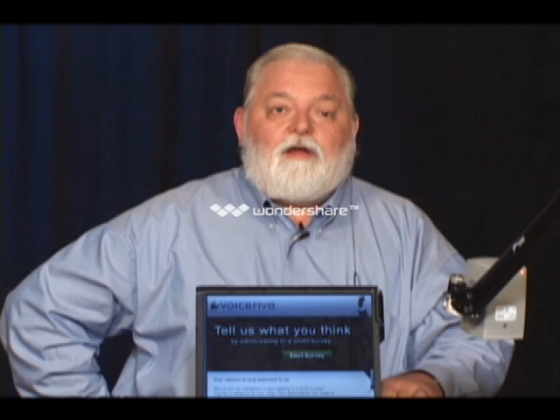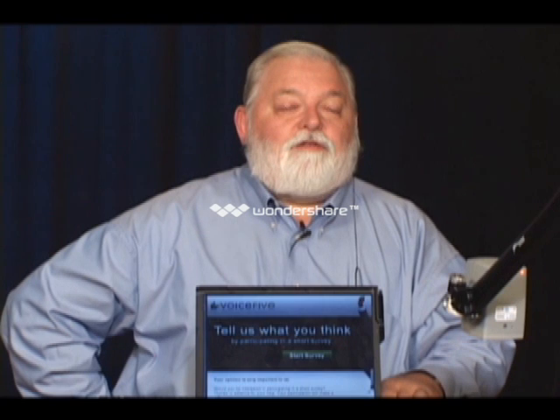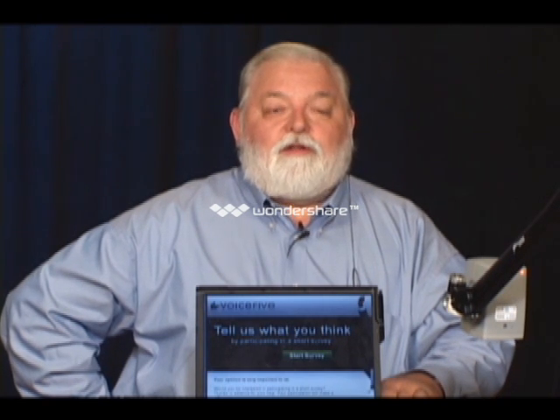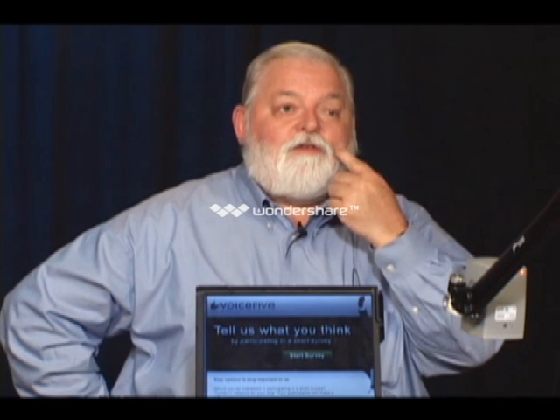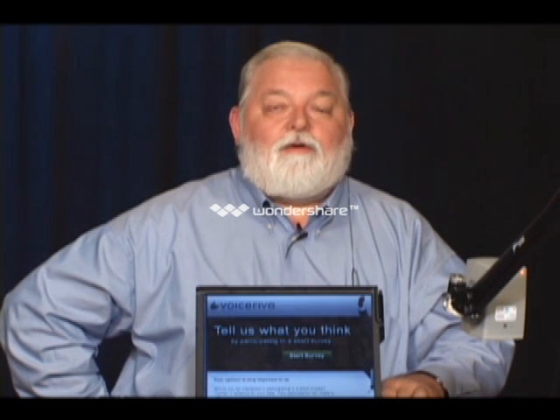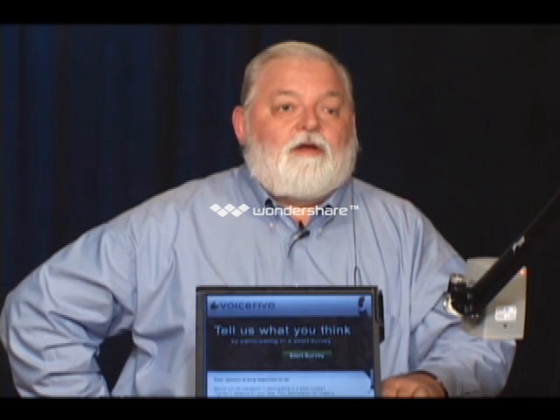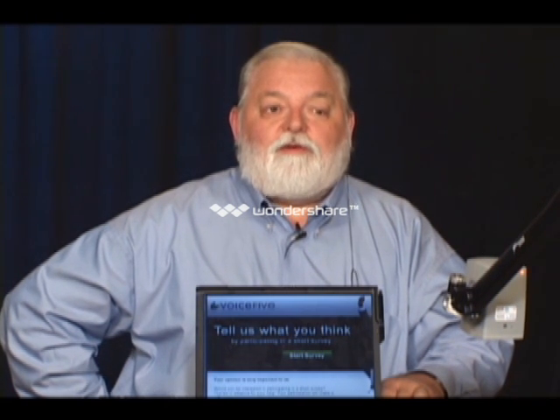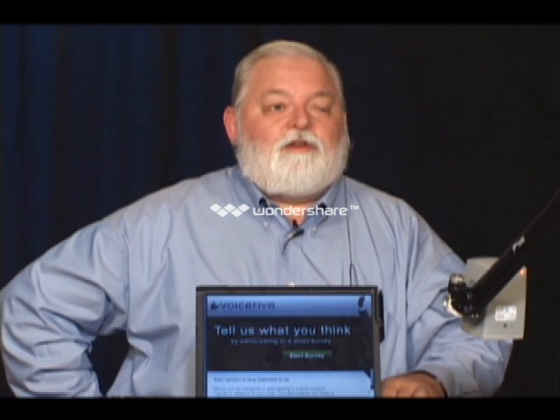And he says, I can press this button and do that, and I can find out stuff. But my wife can look at her GPS screen and say, oh, we're going this fast with this altitude, we're on this street, I can see up ahead of us is this, behind us is that, because vision is a very high bandwidth piece of information, a lot more than audio is. And so JAWS is very linear. Even though you move around on a very busy screen, we get information with audio very linearly, so it's much more different.